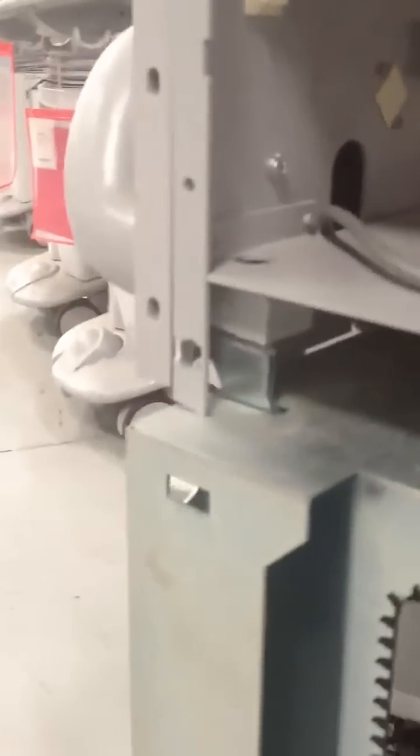And then in here you will see the RJ45 right here. You can remove the cable, and then this cable goes from here to the back of the machine to here. Then you can remove that.